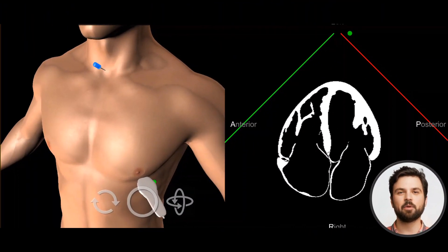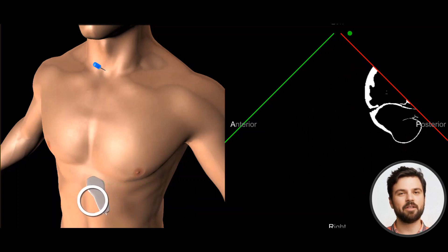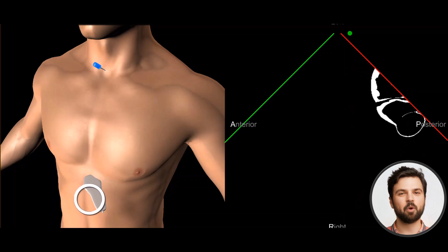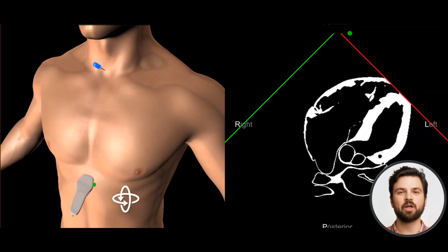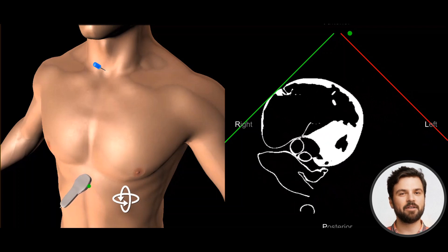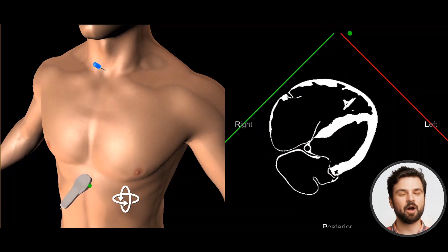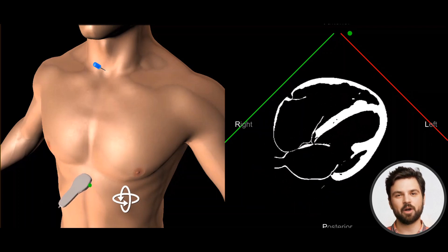We next obtain the subcostal four-chamber view. Place the probe horizontally under the xiphoid process, with the probe angled cephalad. The transducer orientation marker should face the patient's left flank. All four cardiac chambers are seen, with the liver at the top of the display.